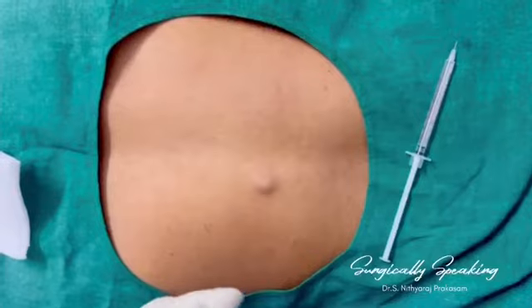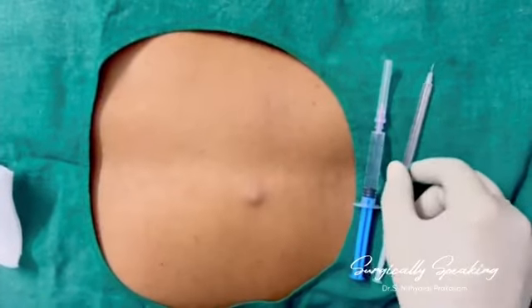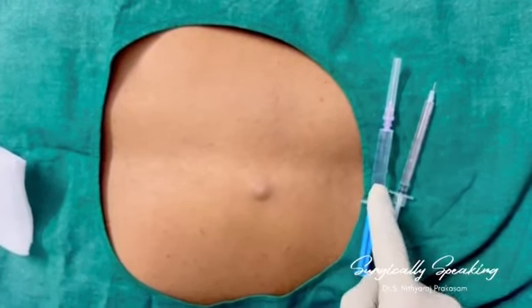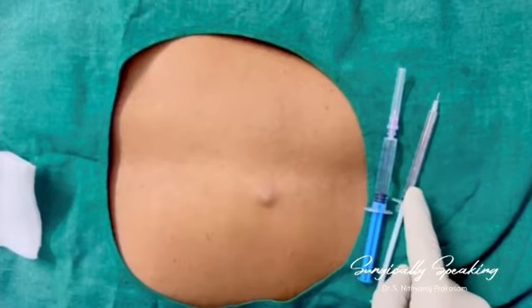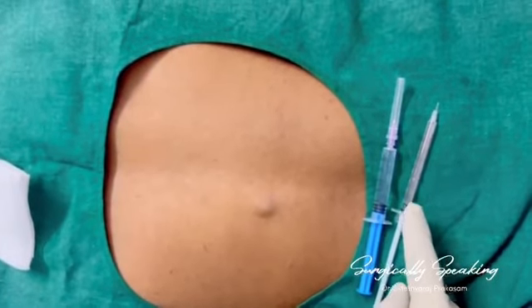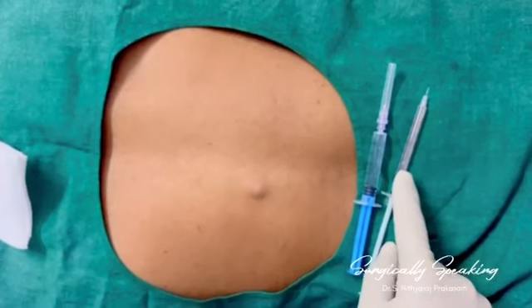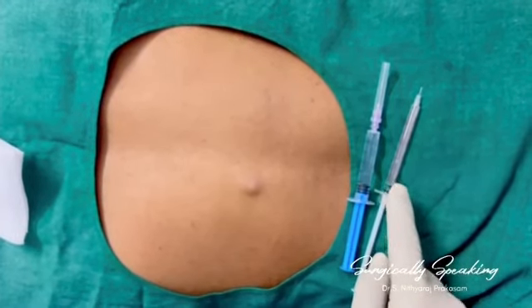So this is the local anesthesia which I have taken, which is 2% xylocaine with adrenaline, and this is the same in an insulin syringe. This is for the field block, and this is for the infiltration along the line of incision.